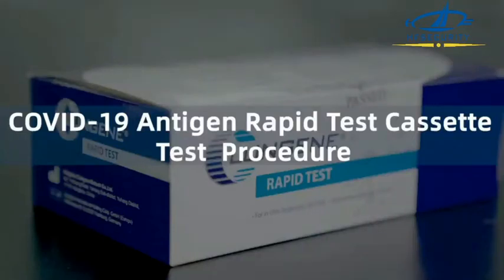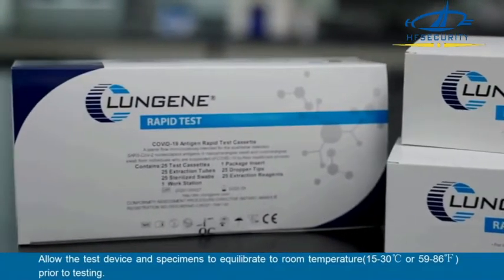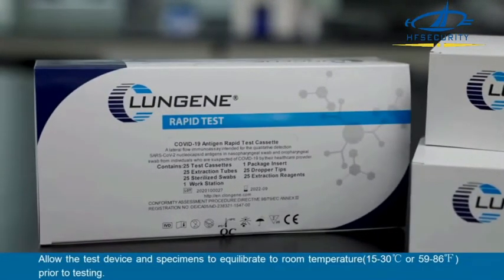COVID-19 Antigen Rapid Test Cassette Test Procedure. Allow the test devices, reagents, and specimens to equilibrate to room temperature prior to testing.